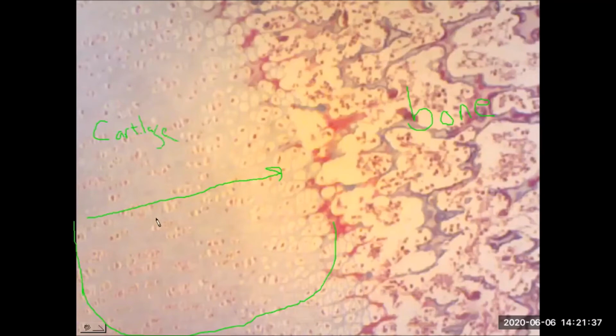As we get closer and closer to the newly created bone, this is where we have the hypertrophied chondrocytes. So I'll just put HC. Hypertrophy is just a word for swollen, enlarged. So as the bone's developing and ossifying and calcifying, the cartilage cells in that area swell up and then, of course, die off. Whereas in contrast, further away from the ossification region, you just see the normal-sized, healthy chondrocytes. But we want to view the enlarged chondrocytes.